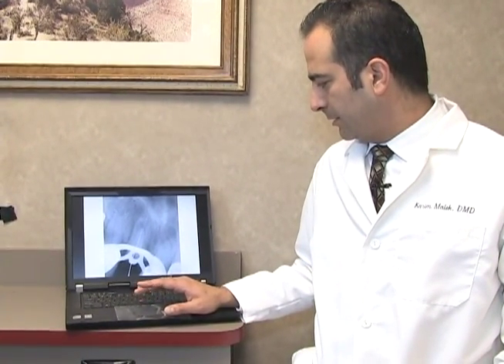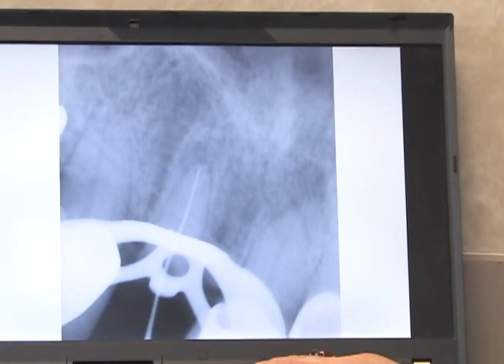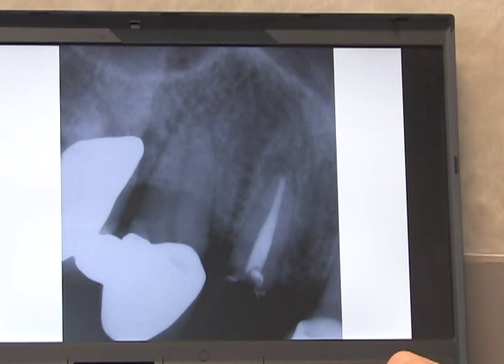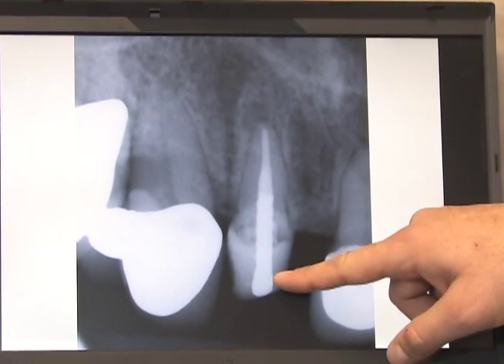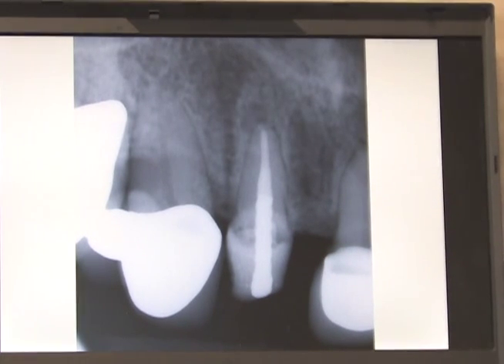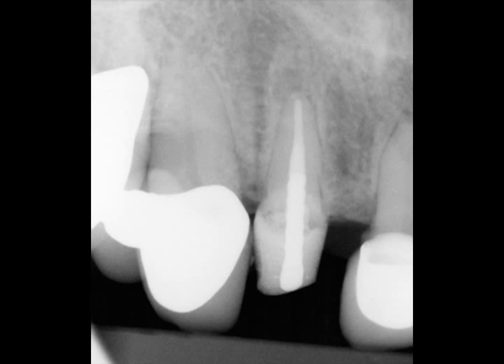We got the rubber dam on with the clamp and did some gingivectomy around the tooth just to make sure we could place the clamp. I got the working length and did the root canal on the tooth. It looks good. We were able to go ahead and put a post on there with buildup. He then went back to the general dentist and got the crown placed. He was very pleased with us for trying to hold on to this tooth. This is another breakthrough as far as trying to save teeth as long as possible.